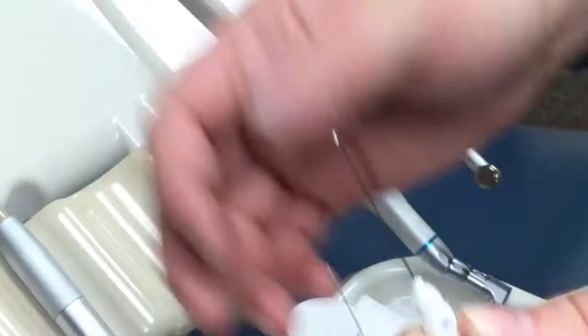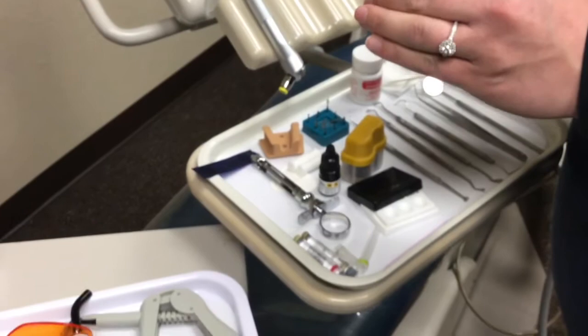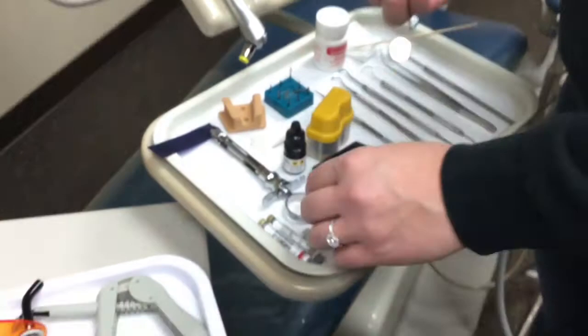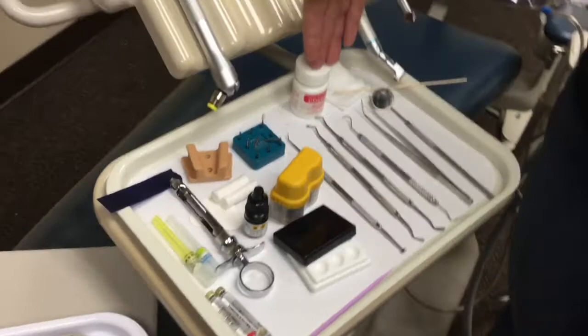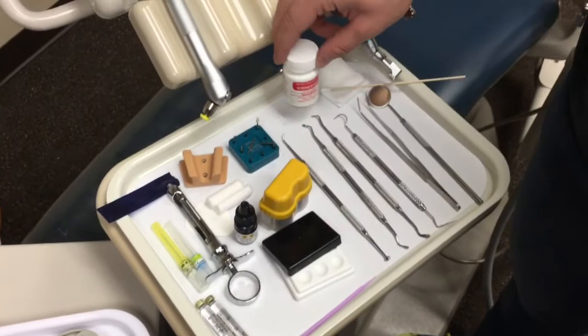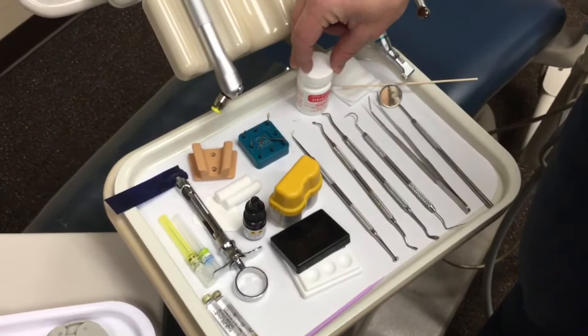You always want to make sure to cap these — always scoop and cap. These are clean needles used for demonstrations. Now moving into the dental materials: the first thing, we want to make sure that we apply topical anesthetic. This usually lasts anywhere from seven to fifteen minutes depending on the strength, so we average roughly about ten minutes. If you put this on, you want to make sure the doctor's in the room within ten minutes to put the local anesthesia in.